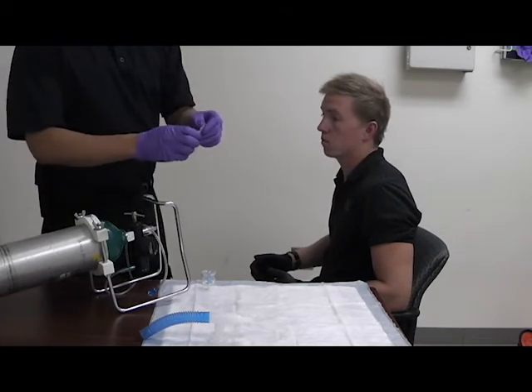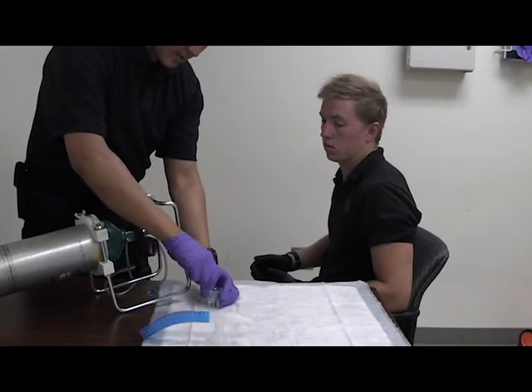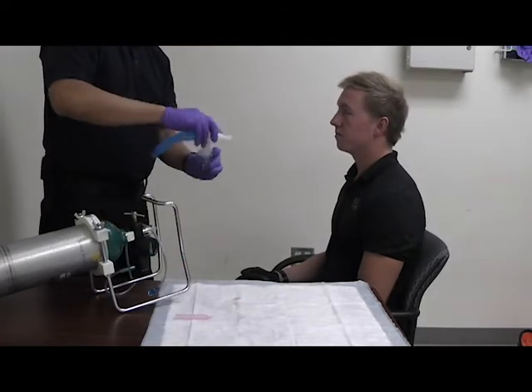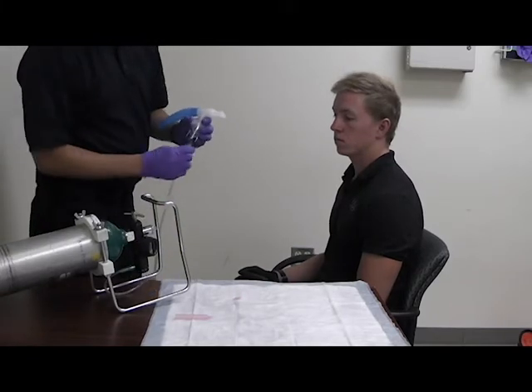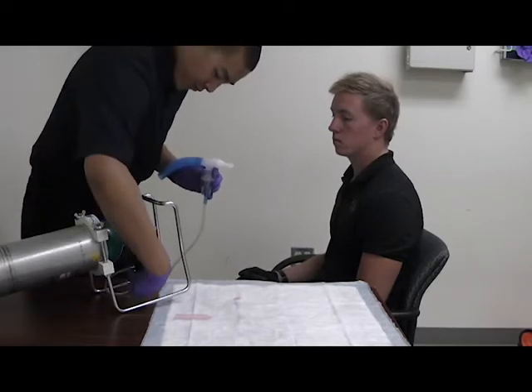I'm going to remove the top from my medication, add it to the nebulizer, and attach the top. Then I'm going to attach it to my oxygen and adjust my flow rate.